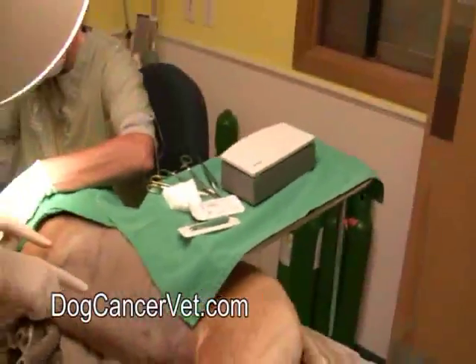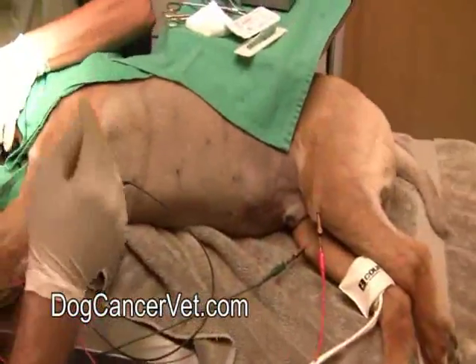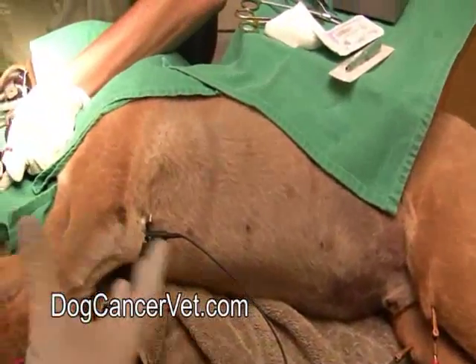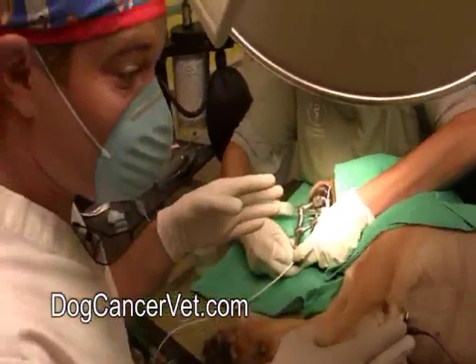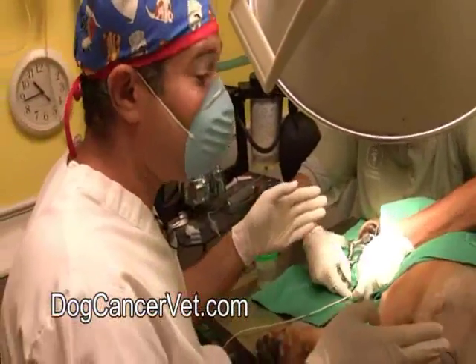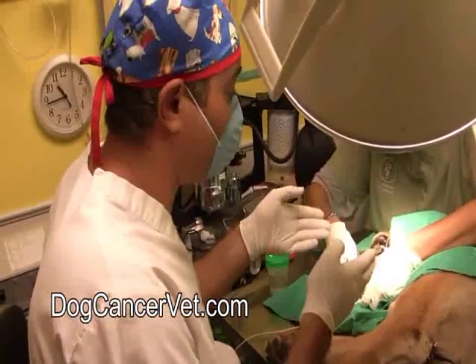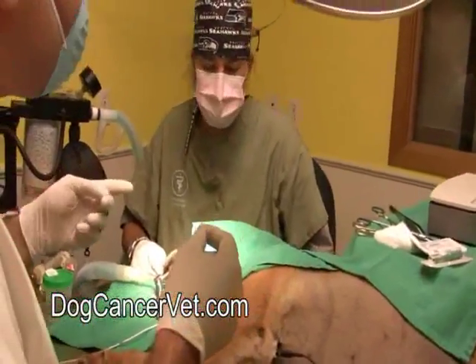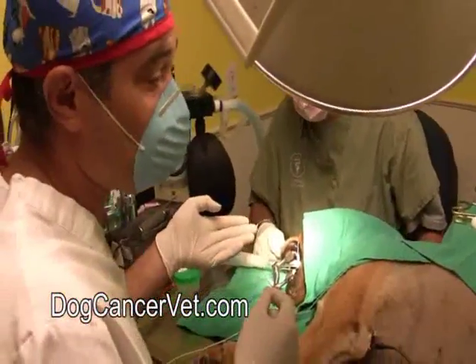We're monitoring his respiratory rate. You can see him breathe right there. And this is how we do monitoring when we're doing surgical anesthesia, to make sure that the animals are all safe. You want to make sure that all of these things are dealt with so that nothing gets forgotten about while we're doing surgery. Karen's my nurse here, and she's going to be helping me monitor all of these things. The surgery is a small one, and it's going to be pretty quick.